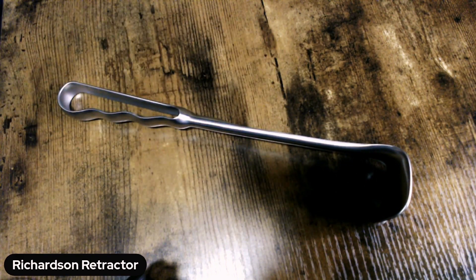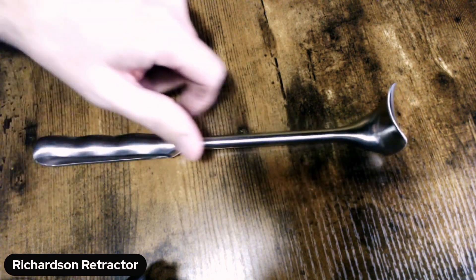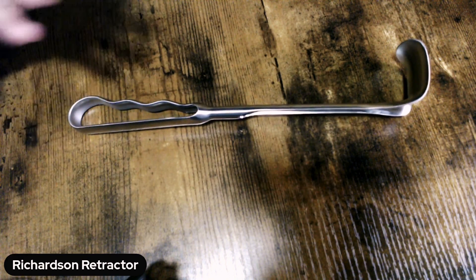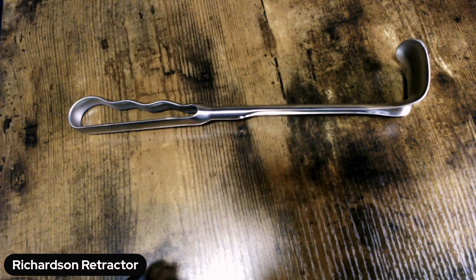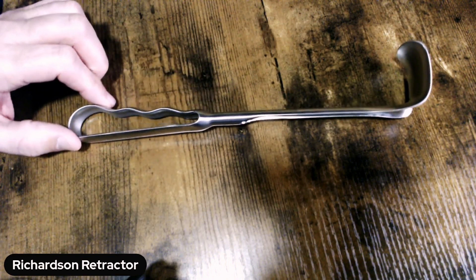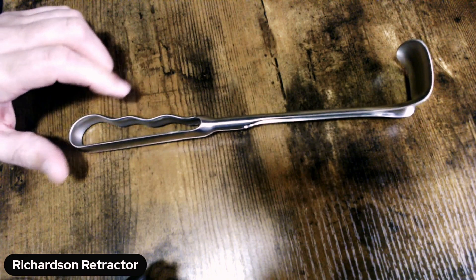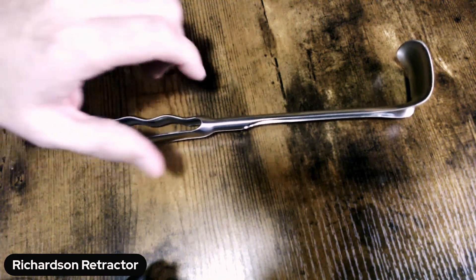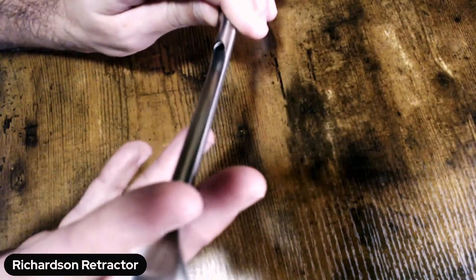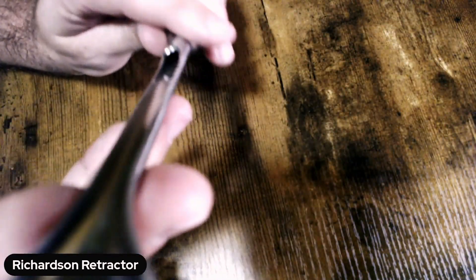One of the unique things about these particular devices is you'll see these handles. Depending on the manufacturer, sometimes these will come with solid handles, or you'll have these cut-out handles that actually make the device much lighter in your trays. And then again, depending on the manufacturer, you'll have a hollow tube right down the middle into the handle itself.